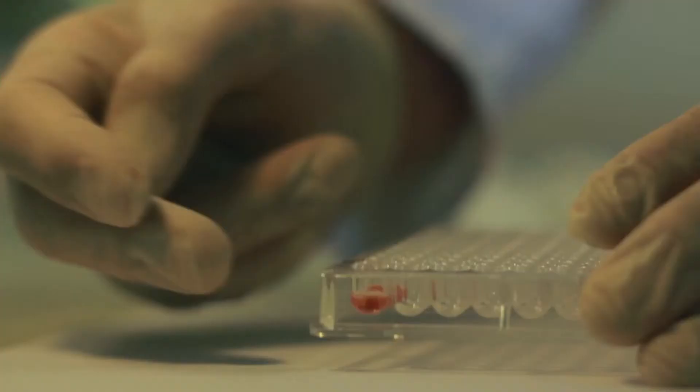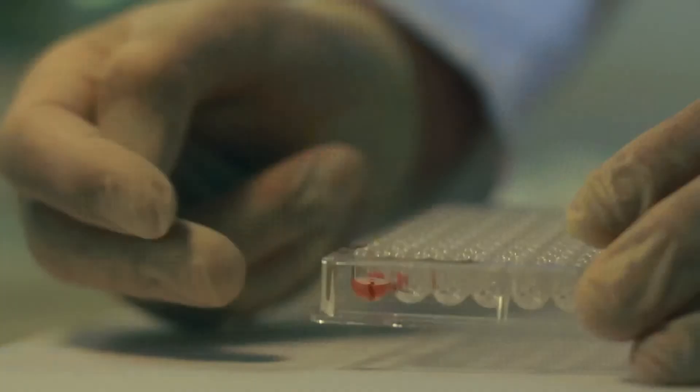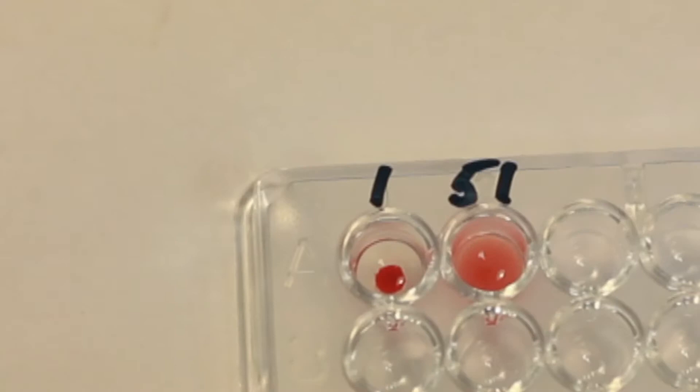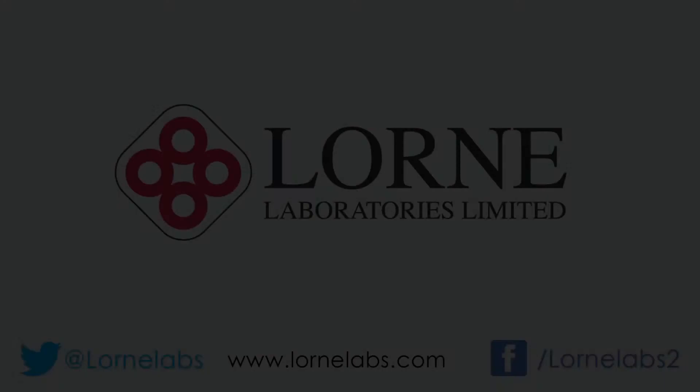The microtiter plate is tapped in order to agitate the contents of the wells. Despite gentle shaking, the positive sample remains agglutinated, whilst the negative sample disperses back into suspension.